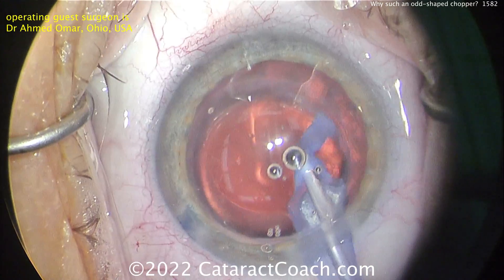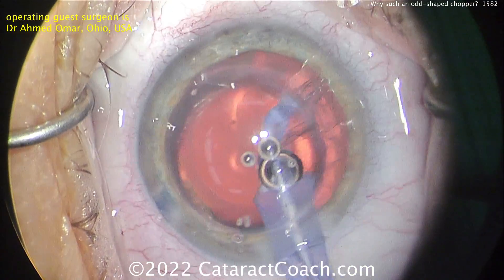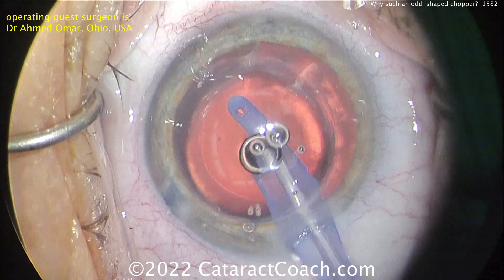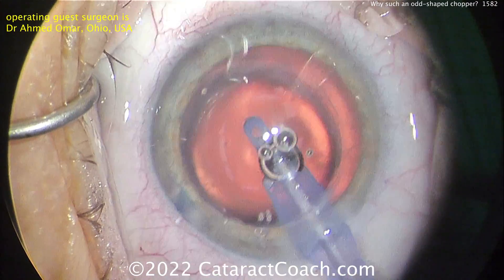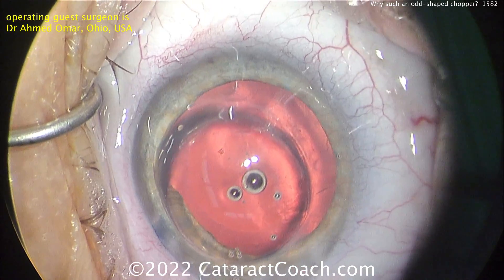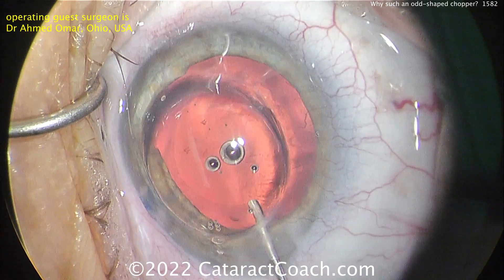So here we go — removing all the cortex. This looks great. That distortion here is because of the cornea, and you can see it looks a little odd during some of these procedures. But as an experienced surgeon, you are able to take care of that. Look how the tip of the probe changes so much as it passes through that zone. Time for the lens, and the rest of the case is pretty normal.